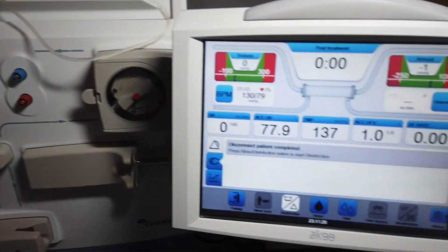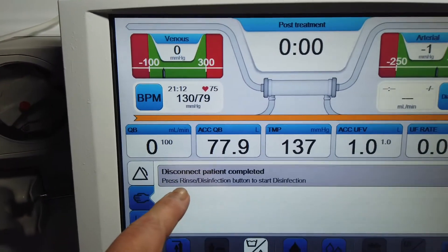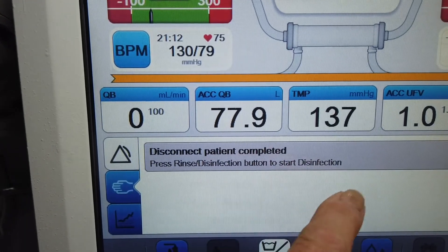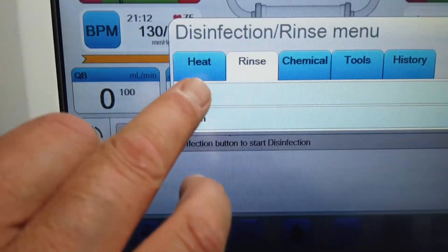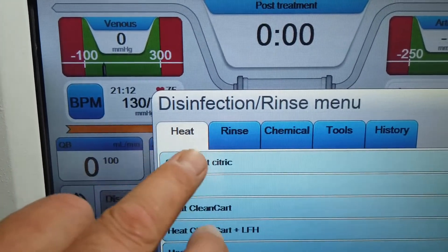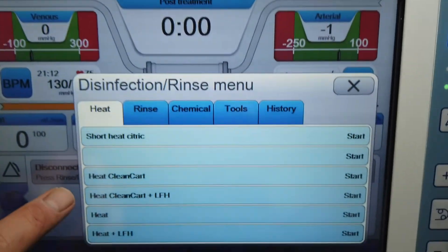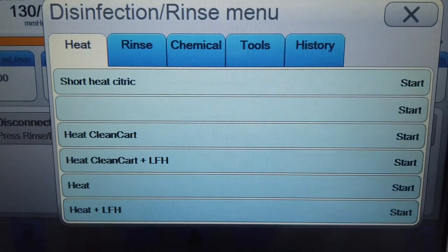Once the hatch is closed, now we can go ahead. If you look at the screen, it says press rinse disinfectant button and start disinfection. So I press the disinfection. I push heat and then I got the manual here. If you press this, which is the heat, clean cart, which is a C.